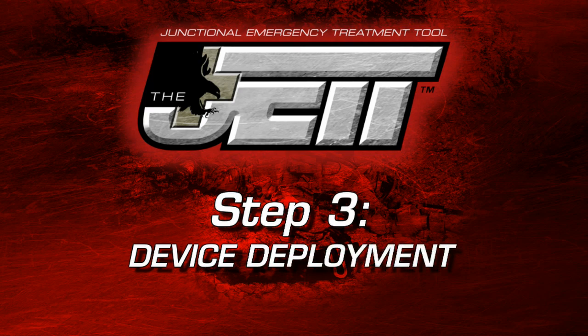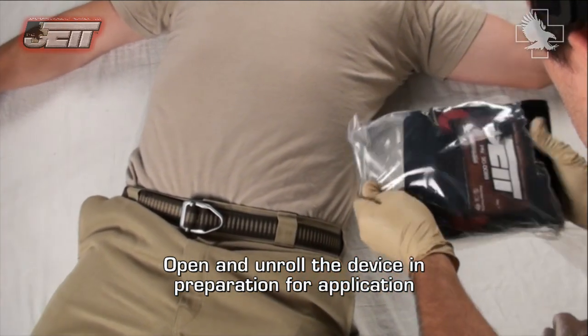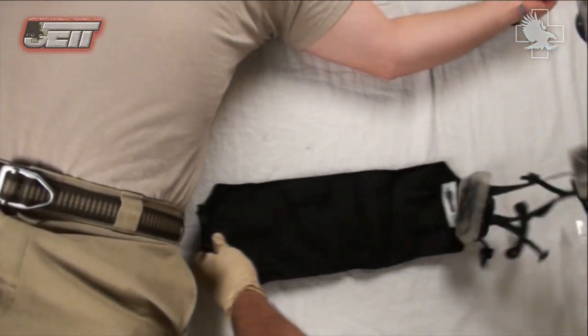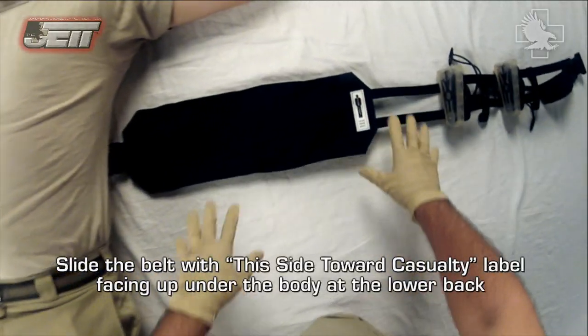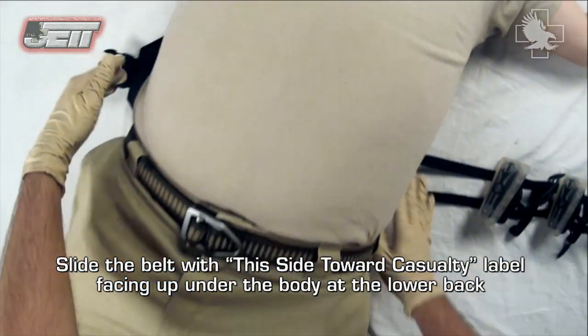Step three: device deployment. Open and unroll the device in preparation for application. Slide the belt with the 'this side toward casualty' label facing up under the body at the lower back.